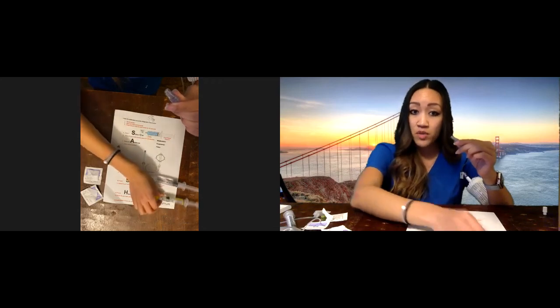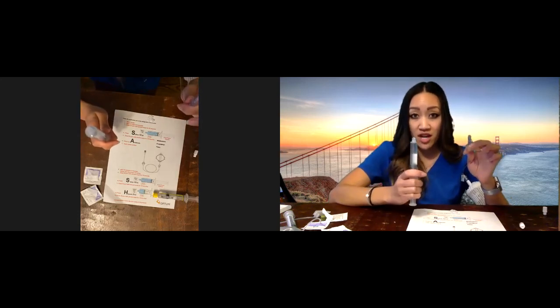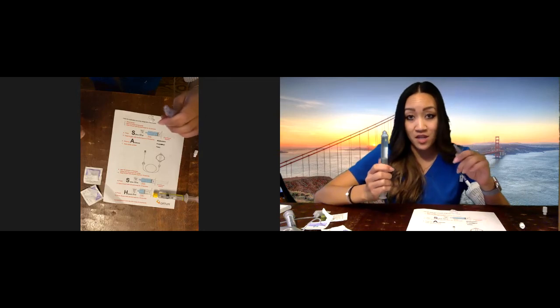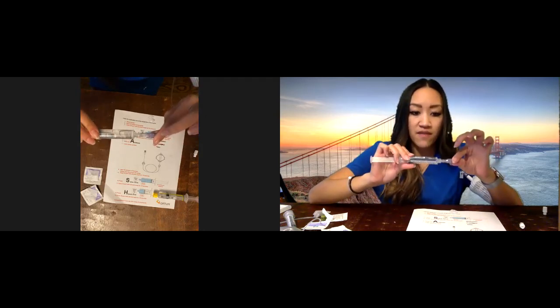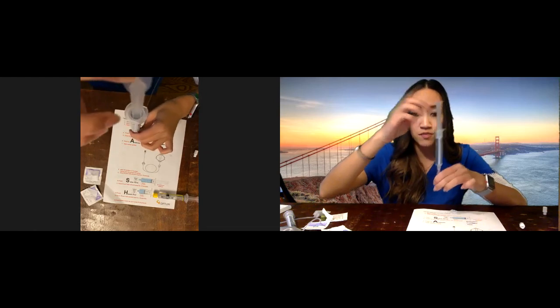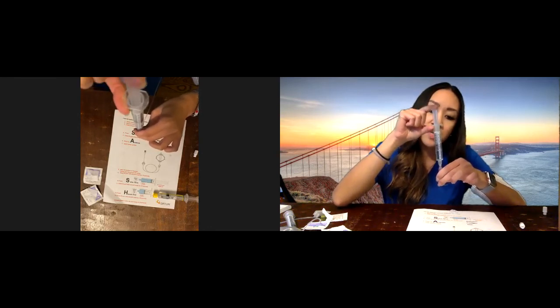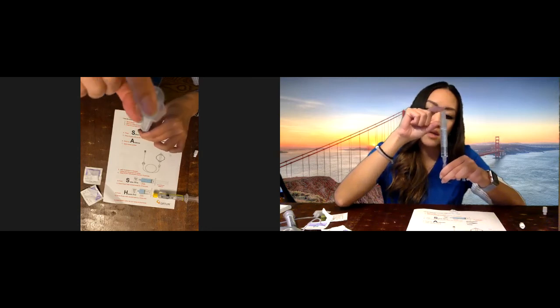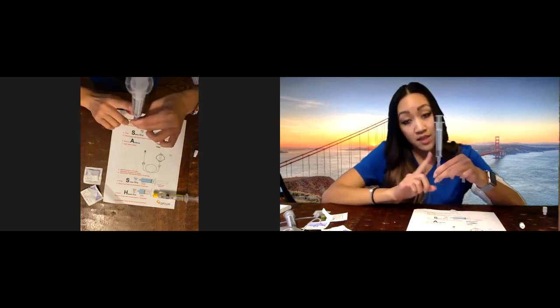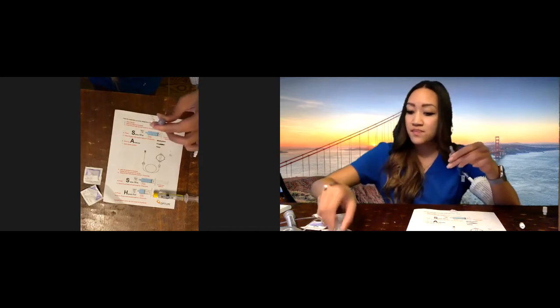Any time you disconnect something from your port, clean for 15 seconds — one happy birthday song. Now we're going to flush again, because you always flush before and after. Here's another way to flush your IV: if you forget to take the air bubble out, turn the syringe upside down so the air floats to the top. Then push-pause, push-pause, and push it down until you see the air bubble, then stop. You want to avoid pushing air bubbles into your IV line — if you accidentally flush a small one, your body will absorb it, but avoid air bubbles at all costs.